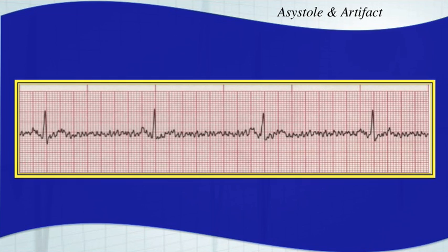Here's another patient with some movement artifact — this is a shivering patient, and you're going to want to try to keep them warm. You can certainly identify the rhythm below this. You can see there's P-waves here and it looks to be a bradycardic rhythm — what looks like a sinus brady. But how do you know that there's not some P-waves over here, and this is maybe a 2-to-1 AV block or something like that? So you're going to want to eliminate that artifact if possible.